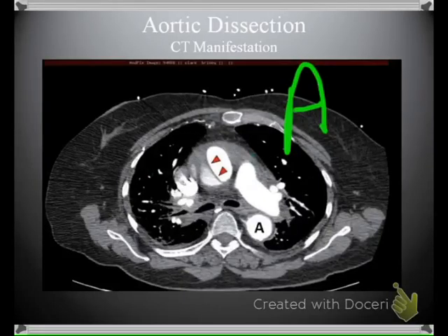And we do see other things going on in this patient's chest as well. We do see something going on here, here, and maybe even here. And because of this, it becomes questionable whether something has begun leaking out into the spaces around the heart. And it's really unknown. The only thing that we have to suggest that maybe it's not is because we have injected contrast, and due to that, hypothetically, we don't see any contrast into these spaces.